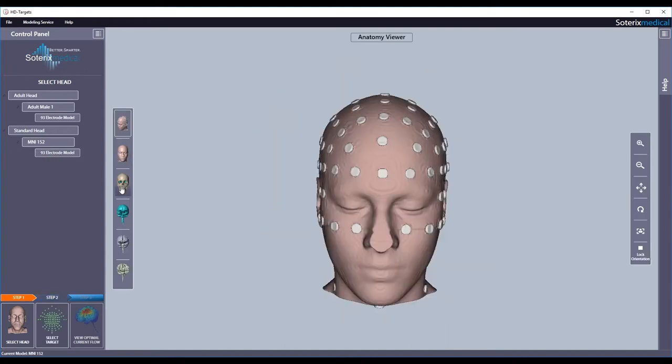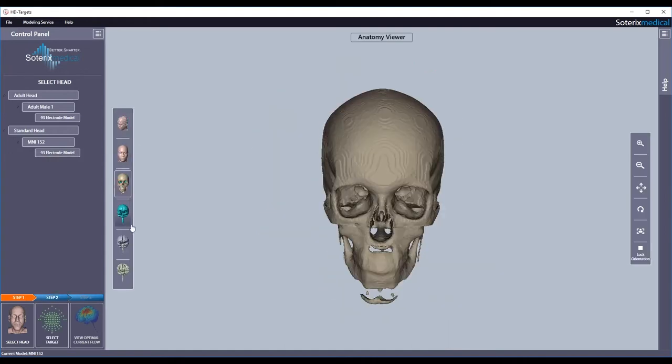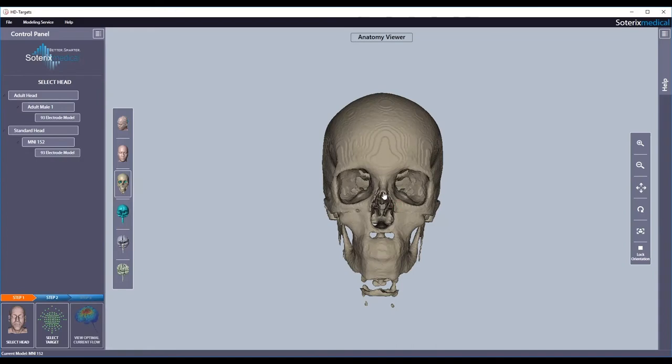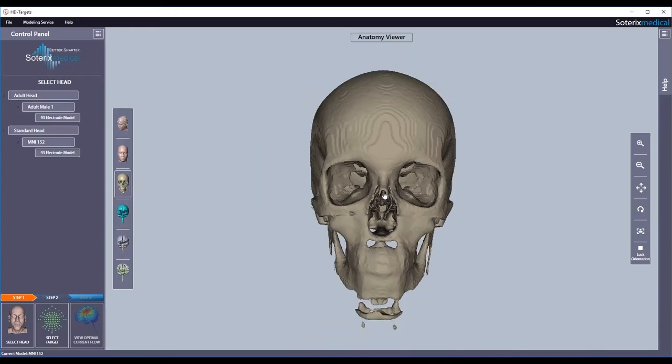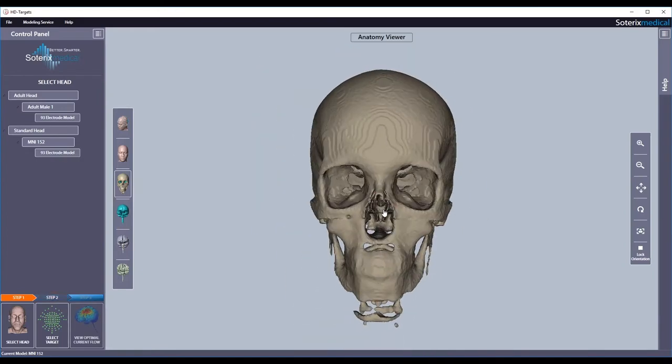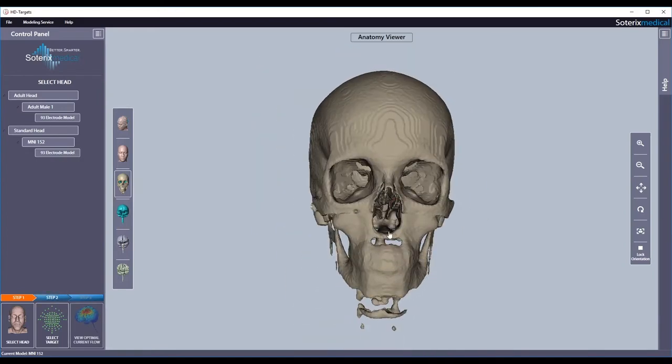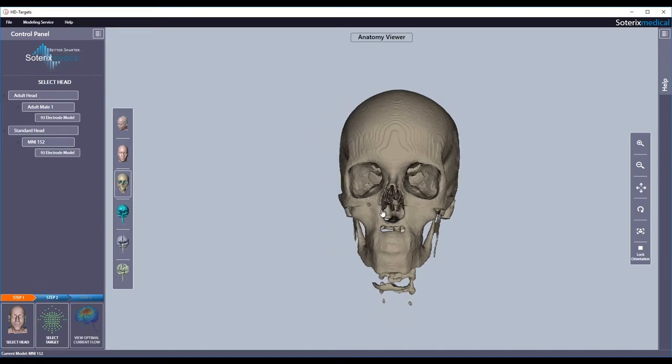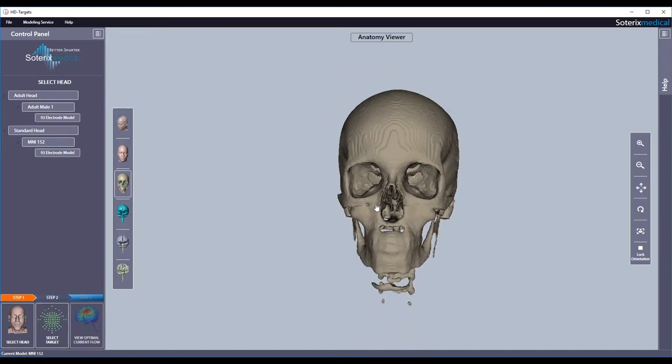Once the head is selected, the different segmentation masks can be viewed in the anatomy viewer in the middle. You can zoom, move, change, and rotate the view using the keyboard and mouse. See the help section on the right for specific instructions.